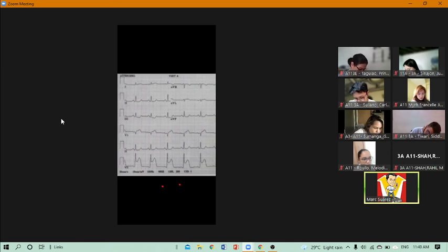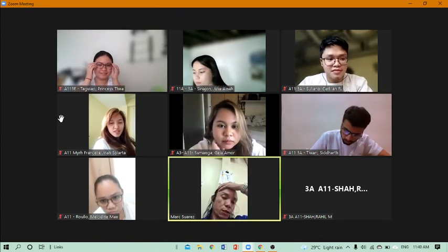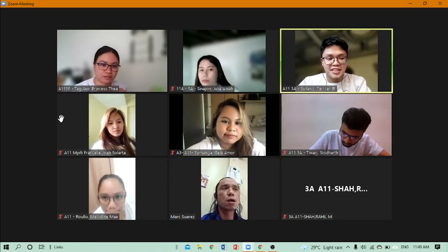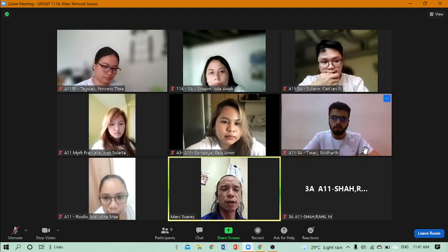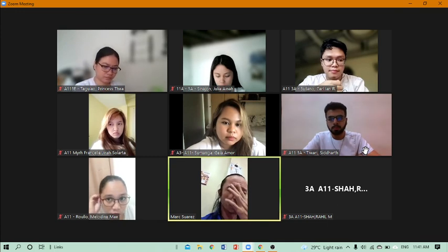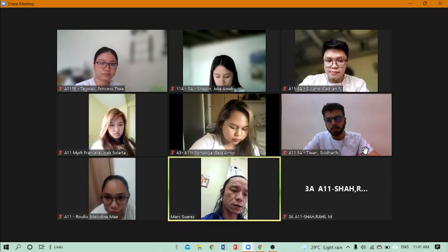Okay. So stop na ta. I'm tired. So is everyone okay? Any questions? None, Doc. With the AVR, we will tackle it briefly this Thursday. Why does the AVR appear or seem opposite from the rest of its colleagues, right?